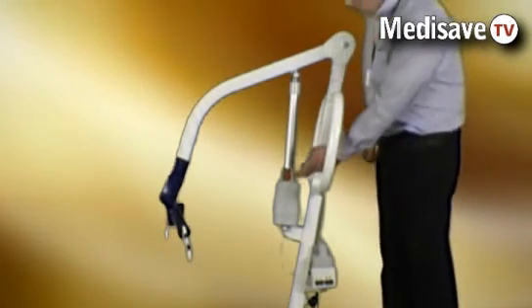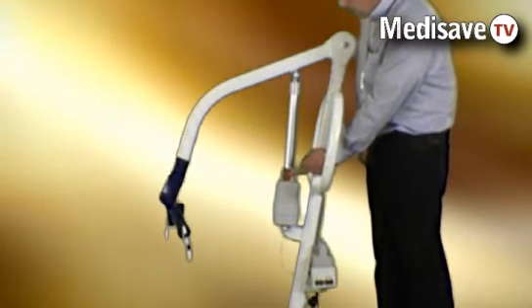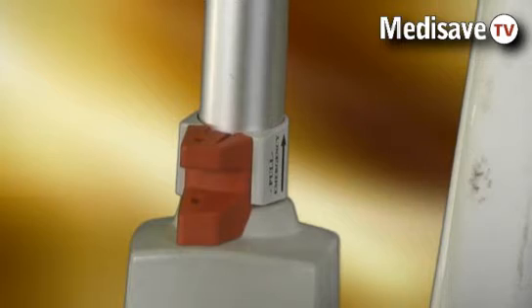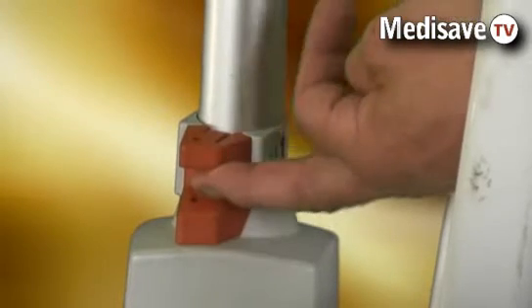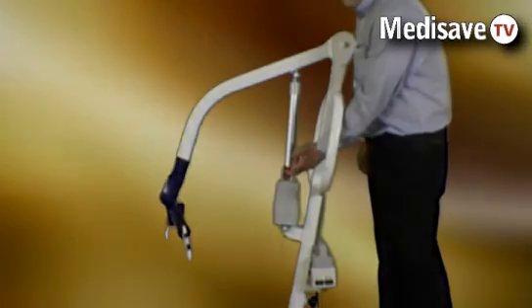We also have an emergency lower button or lever on the actuator. If the battery power completely runs down, we have the facility to lower a client using this lever.